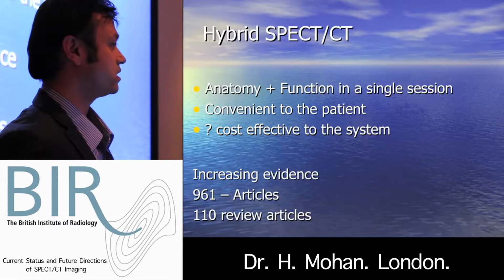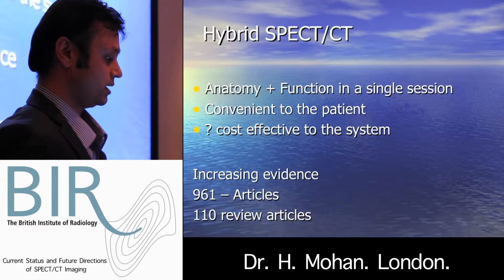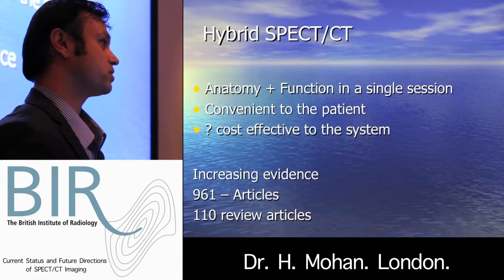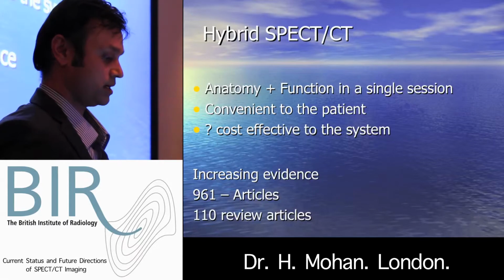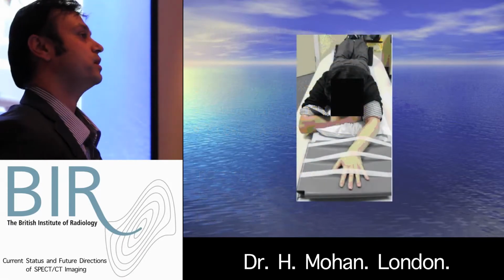And there is increasing evidence for this. About 961 articles, when I looked up yesterday night, have been published on the role of SPECT CT in various indications. So how do we do it?